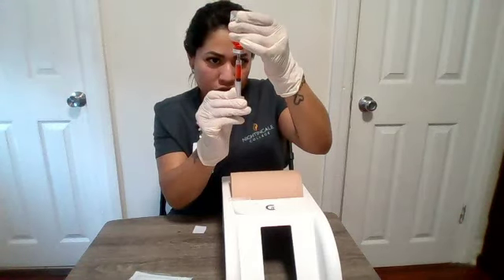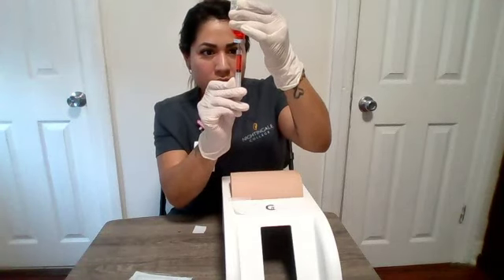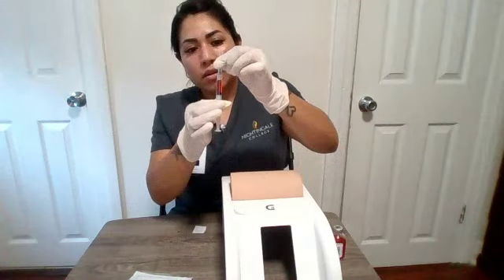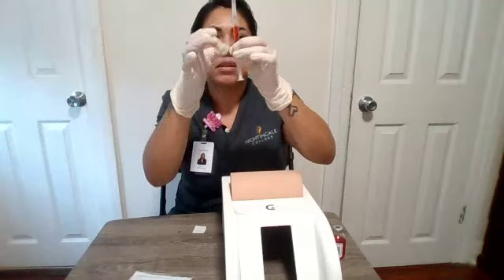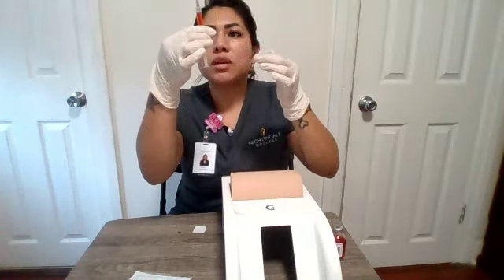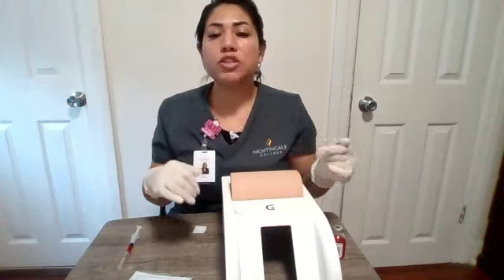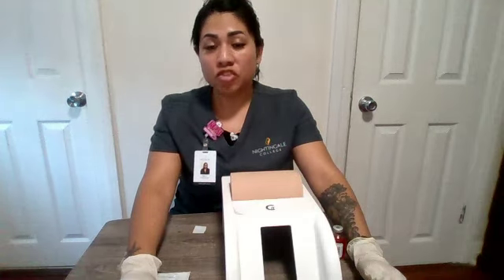Okay, at the same time, I'll be checking for any air bubbles. Okay, 1.5 mLs. Then I will recap my needle, and I will verify that I do not have any air bubbles. And then I will demonstrate my 1.5 mLs of medication in my syringe, and I will put that to the side.